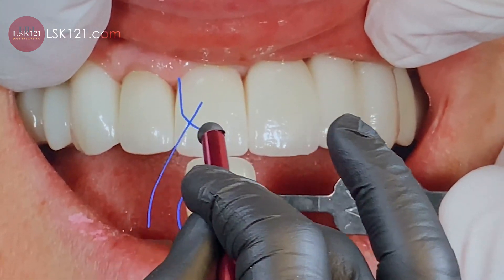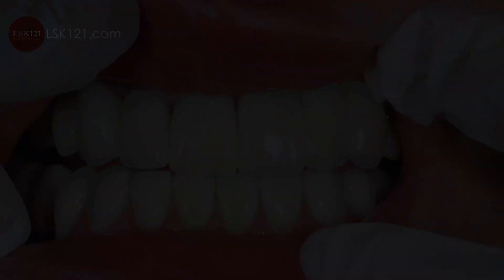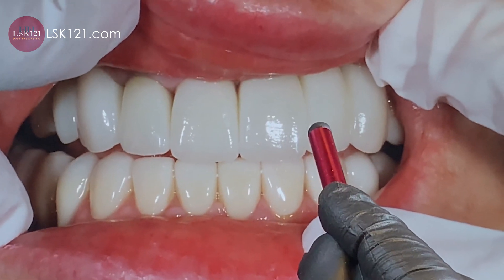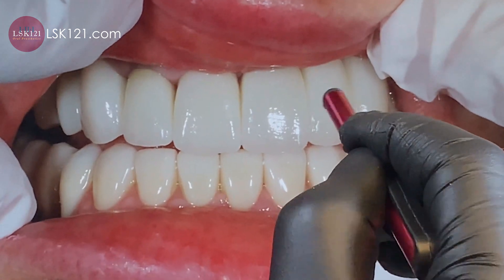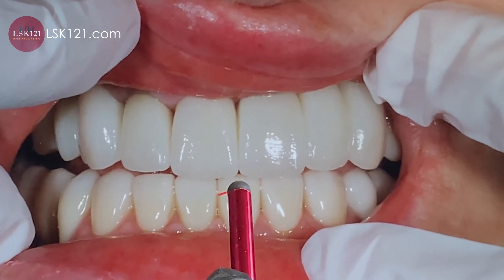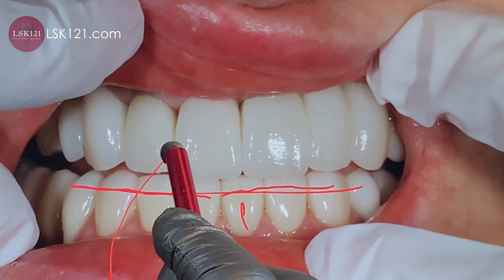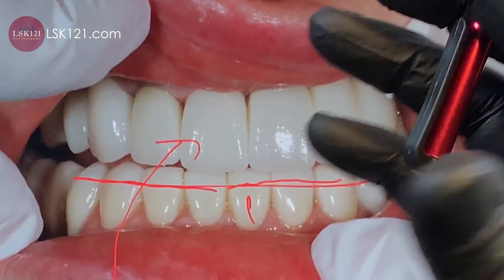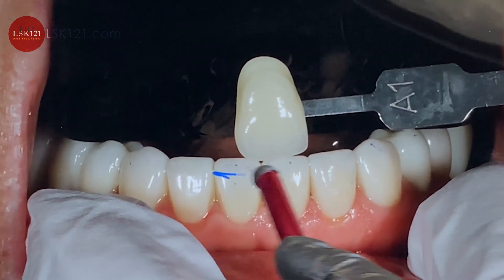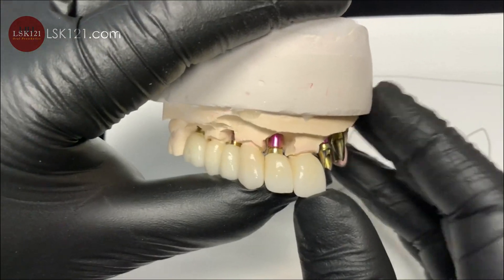You can see they want all of the high value, so we have to change the value here — more darker, just like the lower. High value versus low value: low value is more translucent with a little grayness, reflected color, and enamel. I have to follow the lower exactly for the upper, because top and bottom have to match.